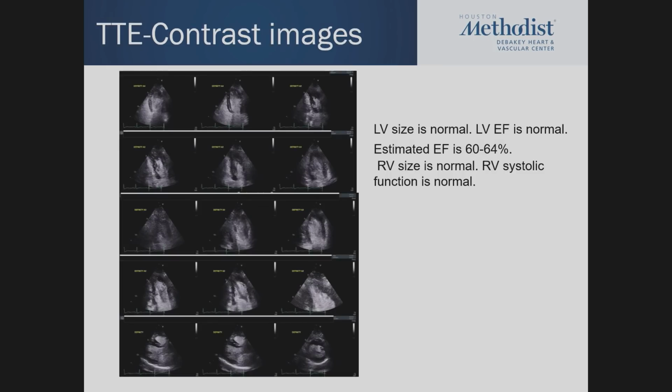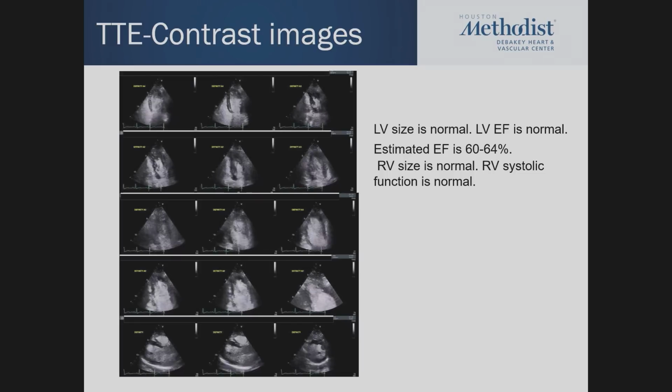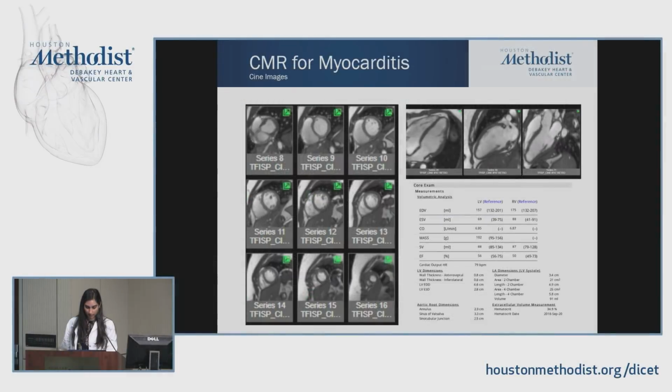Let's see. So a very important point when you're looking at a very young patient who's presenting with a troponin spike of 14, you definitely want to focus on regional wall motion abnormalities, which are non-coronary distribution here. And I would say definitely when fellows are reading echoes, focus on subtle changes in coronary distribution wall motion too, and also look for pericarditis. So myocarditis is a possible differential here. So you definitely want to look at that. And another thing to note, both on CMR and echo, there was no pericardial effusion or pericardial thickening noted.